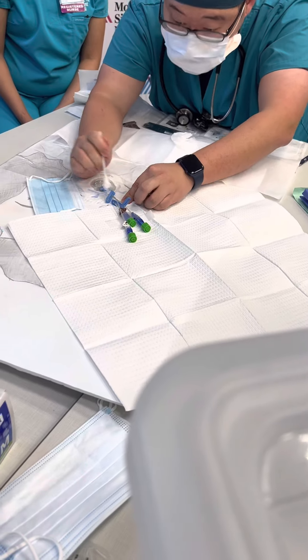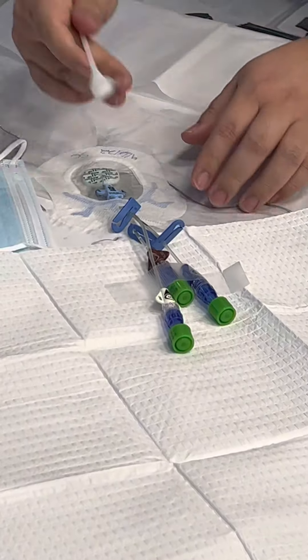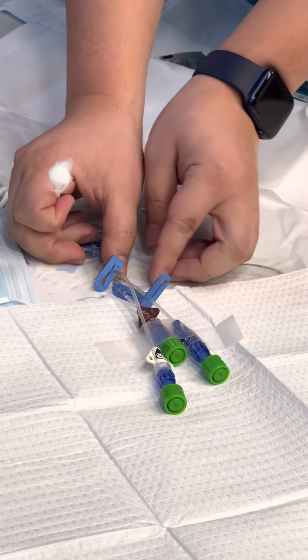Sometimes it's helpful when you're changing a central line to have a second person there, especially if the patient is turning their head a lot if it's on the IJ. Where are the other sites that we could have a central line?